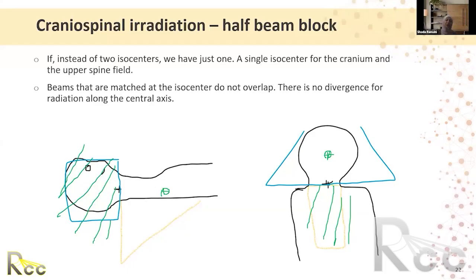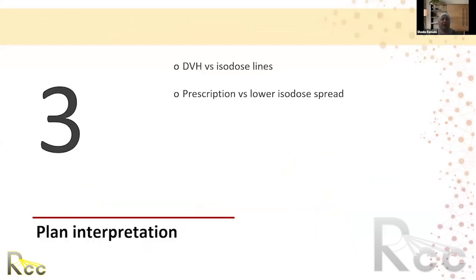For breast, when I'm doing tangential and the supraclav field, the match will be deeper in the soft tissue. So you will not see it on the patient's skin, but it is there deeper. It might add to the patient complaining of pain inside their arm or something like that. So keep that in mind.